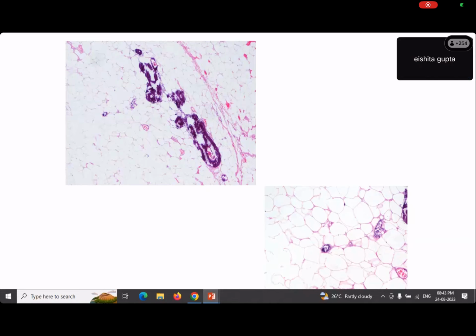Do we have anyone who's typing in the diagnosis? Variable opinion: fat necrosis, calciphylaxis, mycetoma, eschar, calcification around fat. Calciphylaxis by many people. Okay, so I think whoever called it calciphylaxis ought to pat themselves on the back. So yes, it is indeed calciphylaxis.